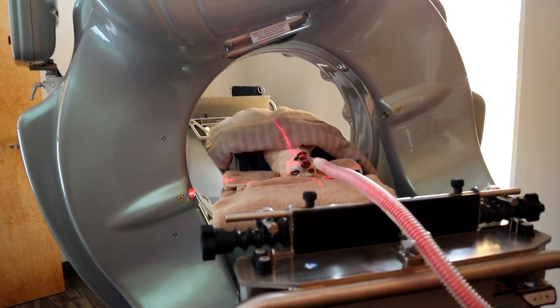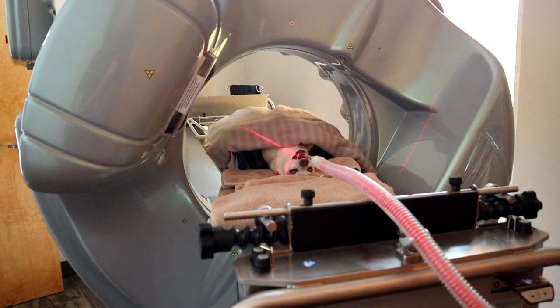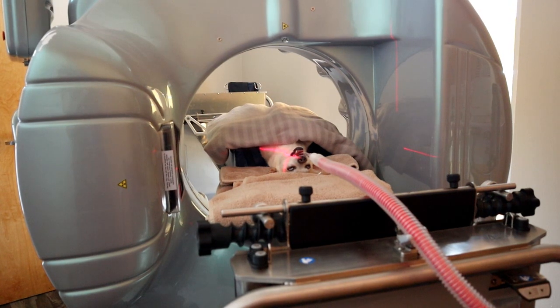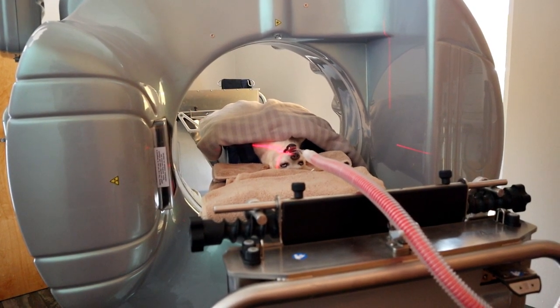Izzy is running the fluoroscopy, which in this case is just two scans — one at 90 degrees and one at 180 degrees — to make sure that we have her positioned correctly and that her mouth is at the center of the scans. Throughout this whole process, he and I are in constant communication so that he knows he's clear to move the machine.